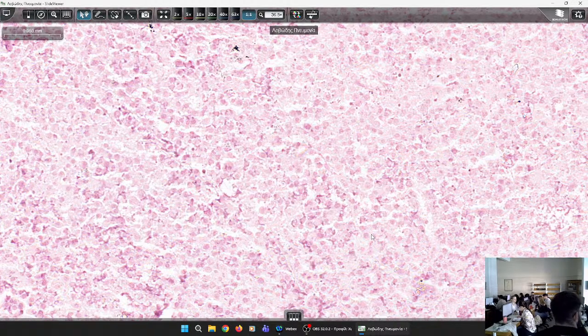The necrotic material caused by the toxins of bacteria, how is it called? It's a type of necrosis. It's not the caseous necrosis that tuberculosis does, it's liquefactive necrosis. But from a clinical point of view, excellent, this is called pus.